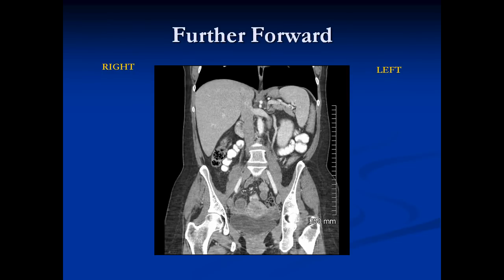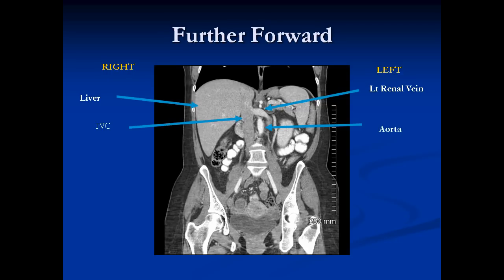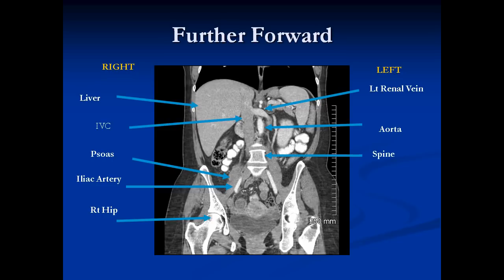Coming even further forward, we see other vascular structures while still seeing the retroperitoneum centrally. The liver and inferior vena cava are visible — the inferior vena cava courses through the liver as it goes up towards the heart. This structure coming across the aorta is the left renal vein. There's the aorta and the psoas muscles. Sitting on top of the psoas muscle is a white structure — these are the iliac arteries, one on each side. This is the right hip and the spine.